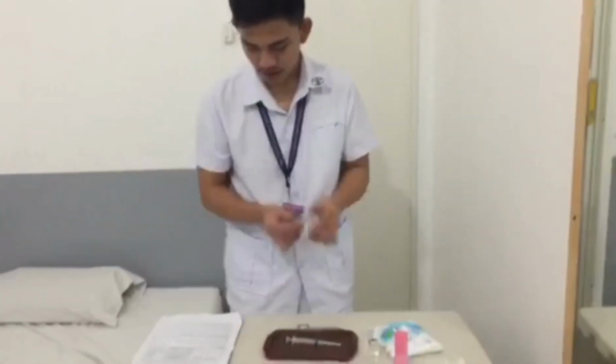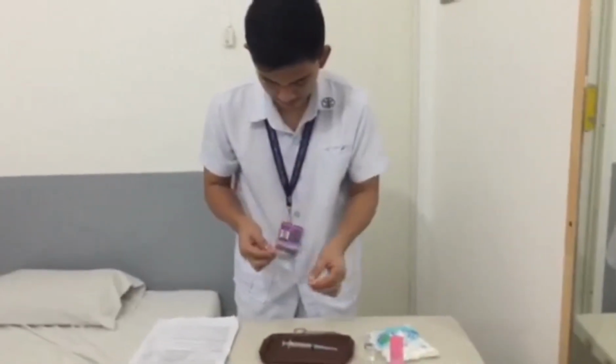And then we will remove the protective cap.